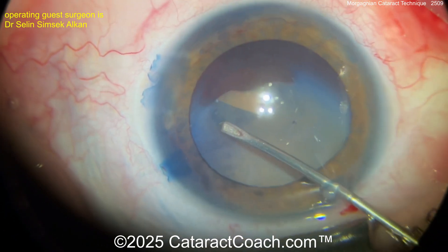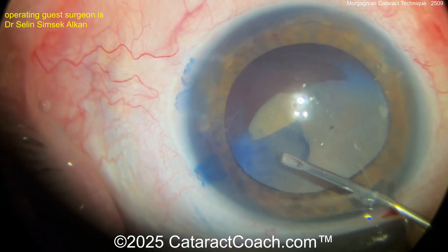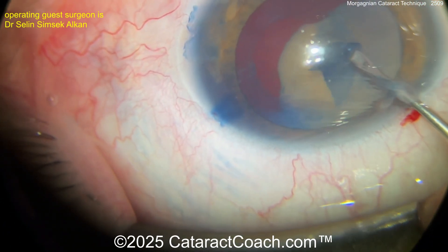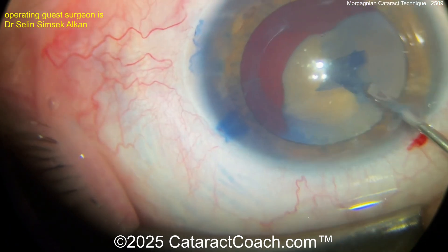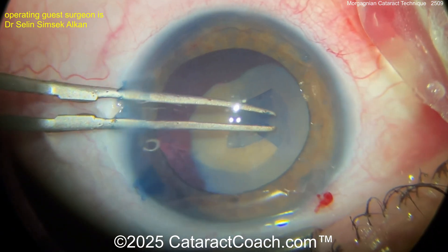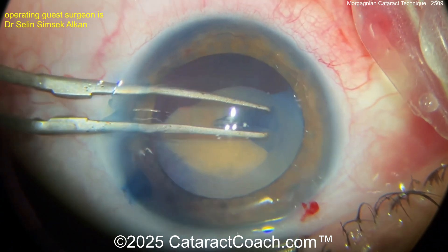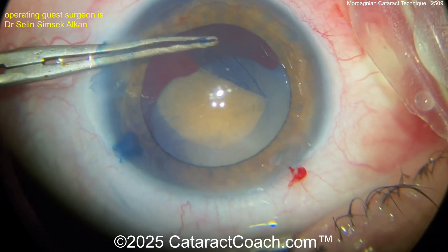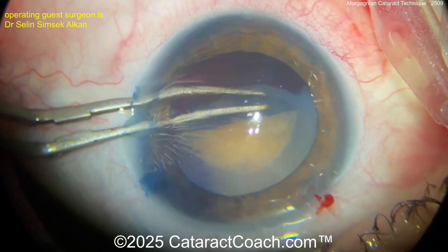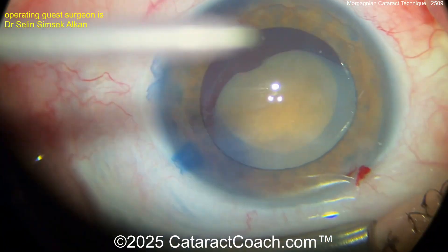This surgeon is doing a beautiful job getting the rhexis done. This is fantastic — and not so easy. Look how small the nucleus is, and it's partially sun-setted. We'll see the whole nucleus as we start doing the phaco, but getting a beautiful rhexis done here — not switching to forceps, just finishing that rhexis up. Very nice technique. The risk of Argentinian flag sign here is kind of low, so it's not something to stress about. Just get a nice-looking rhexis. That is it.